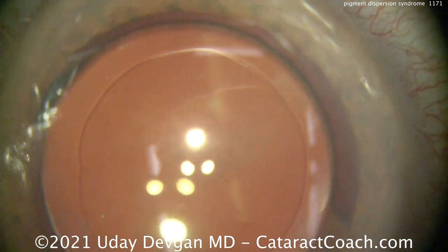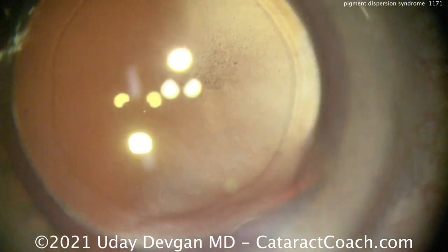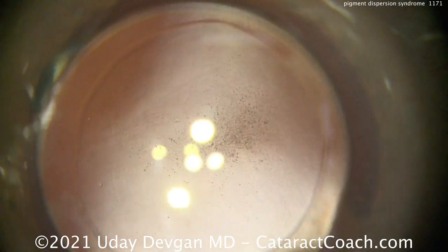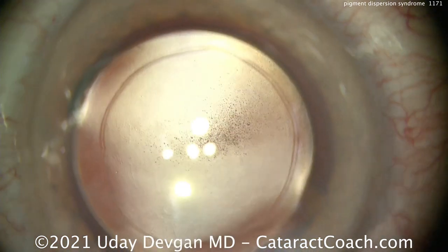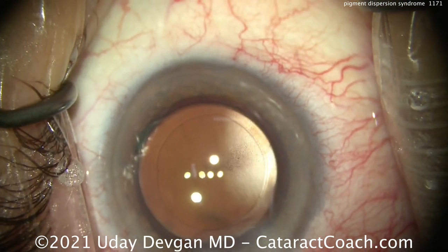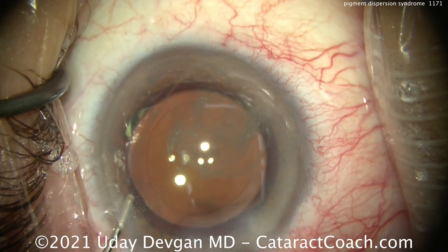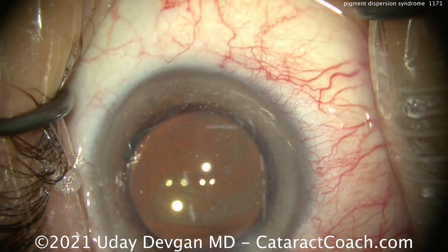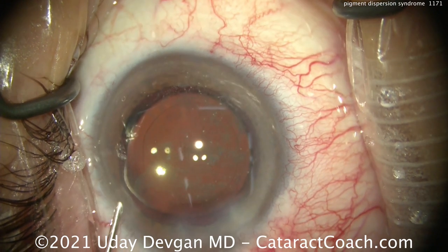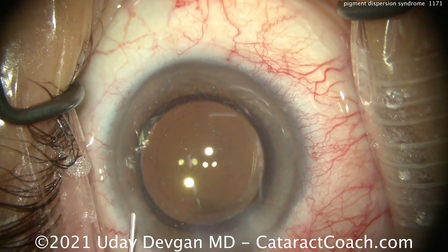We're also going to vacuum out some of that pigment from the angle. Here we're zooming in on that Krukenberg spindle — look at that cornea, there's that pigment, a beautiful textbook picture of pigment dispersion. Remember, we're replacing that thick human lens — 4-plus millimeters thick — with a very thin lens, in this case less than 1 millimeter. By doing that, we're giving the iris tissues less opportunity for dispersion, bringing them further away from the zonular support, capsule, and ciliary body.